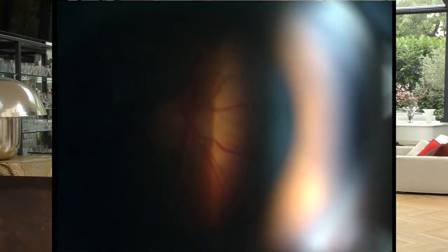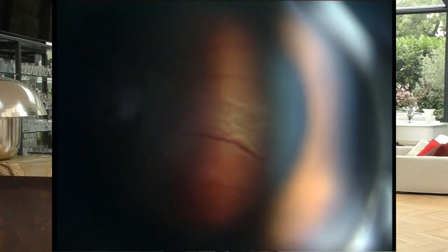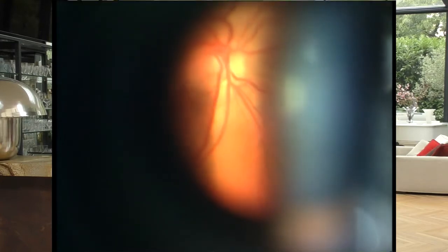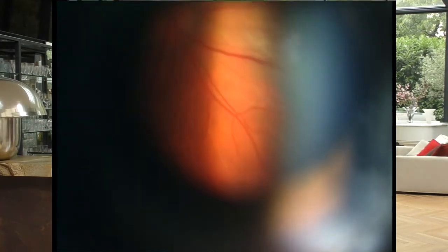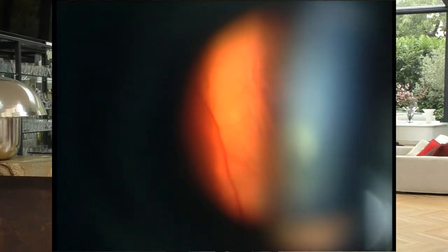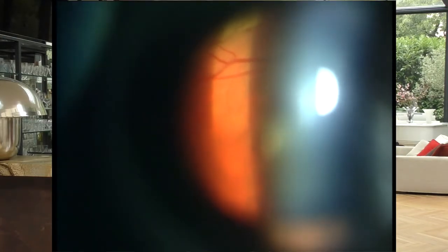I was also afraid that at the end of the examination, all absorbed by the examination of the periphery, I would forget to look at the macula. I took advantage of this lens to make a small retroequatorial tour and establish the limits of the detachment that I noted on my drawing before placing my contact lens and looking at the periphery.